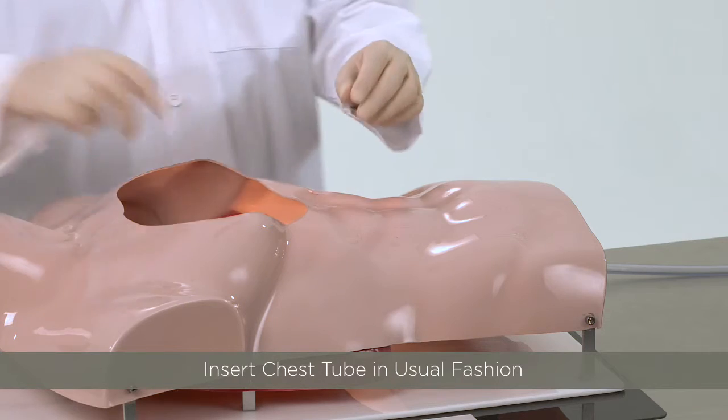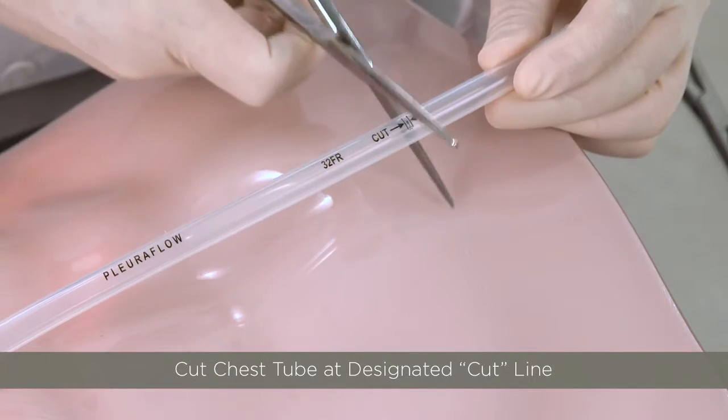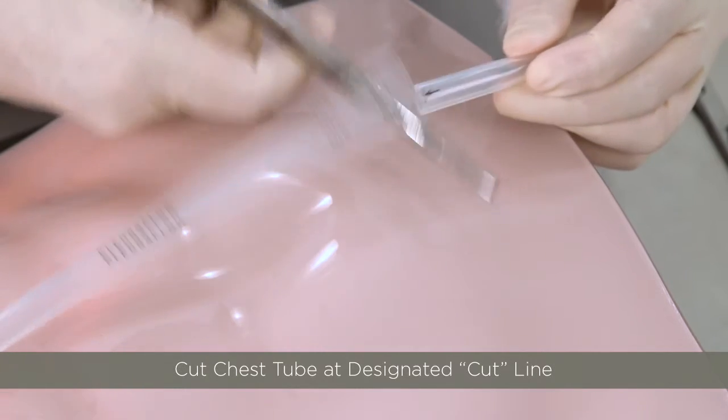Placement of the PleuraFlow System is easy. The surgeon simply inserts the silicone chest tube in the usual fashion. Once inserted, the chest tube needs to be cut at the designated cut line. This will ensure that the clearance wire and loop is the correct length for the chest tube.